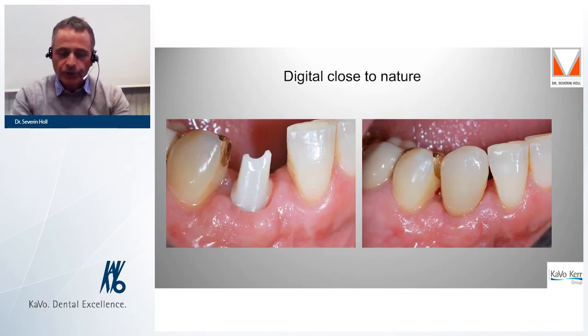I hope I showed you an overview of our various treatment concepts that we use in our dental practice since the implementation of digital planning with a huge success. Let me close by saying digitally we come closest to nature. Thank you very much for your attention.